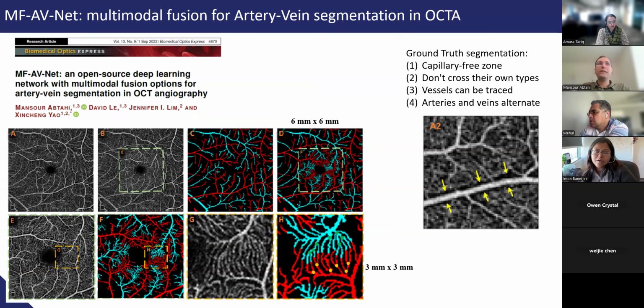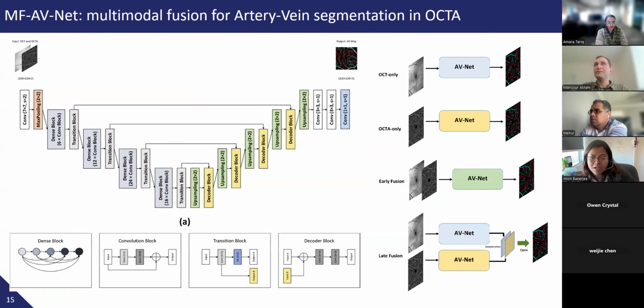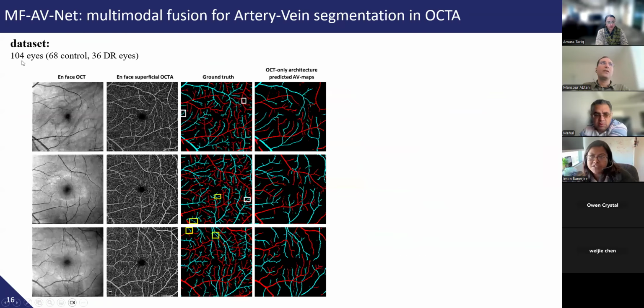And actually, I believe that if we have a limited data set, the only option that you have is to have a very clean ground truth. Yeah, very clean ground truth to have a good performance. So somebody manually checked it, you said, right? Yes. Did you also have a balance between the diabetic retinopathy and the normal ground truth, or is it only collected on a particular population?